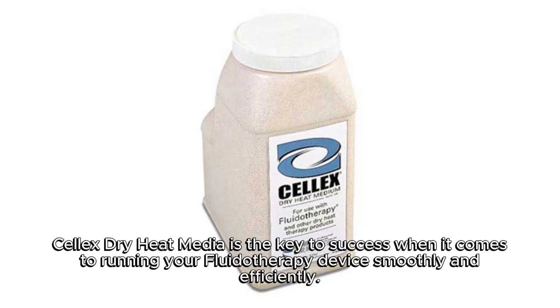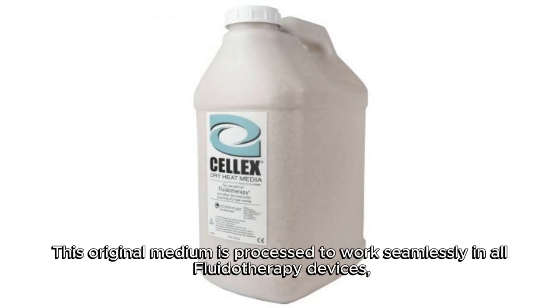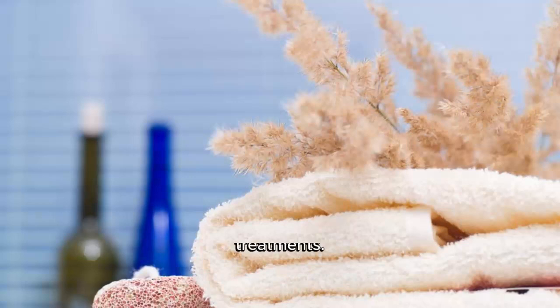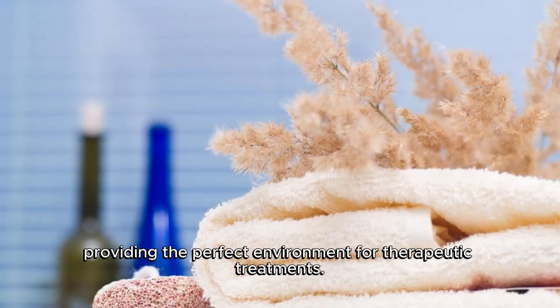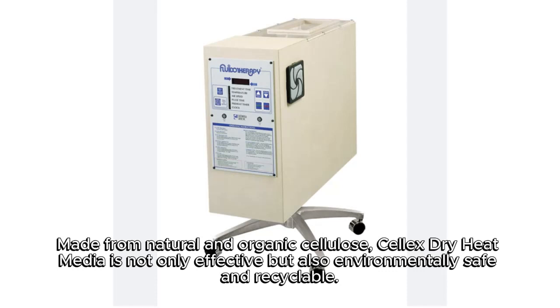Cellex Dry Heat Media is the key to success when it comes to running your fluidotherapy device smoothly and efficiently. This original medium is processed to work seamlessly in all fluidotherapy devices, providing the perfect environment for therapeutic treatments. Made from natural and organic cellulose, Cellex Dry Heat Media is not only effective but also environmentally safe and recyclable.